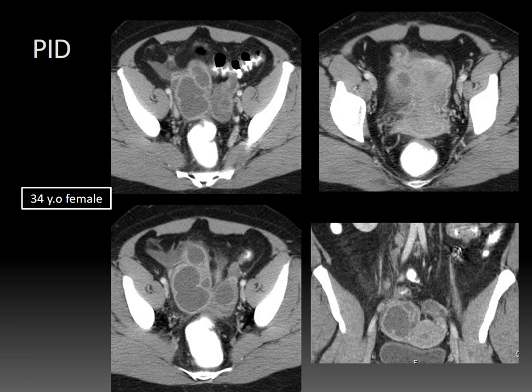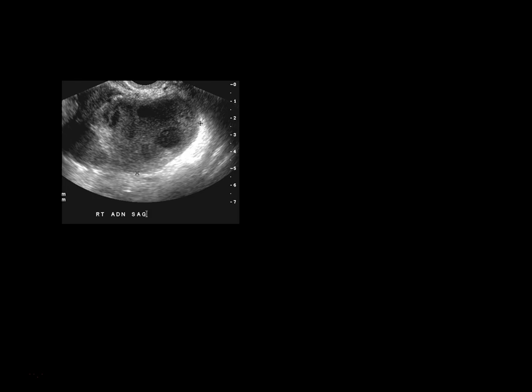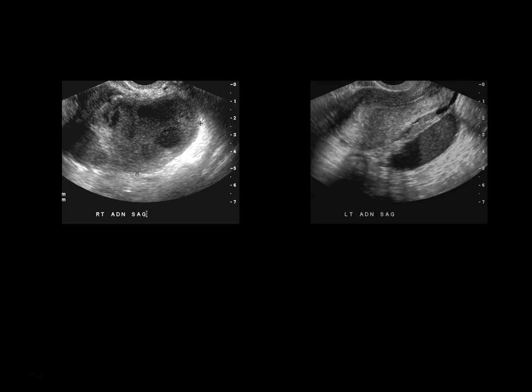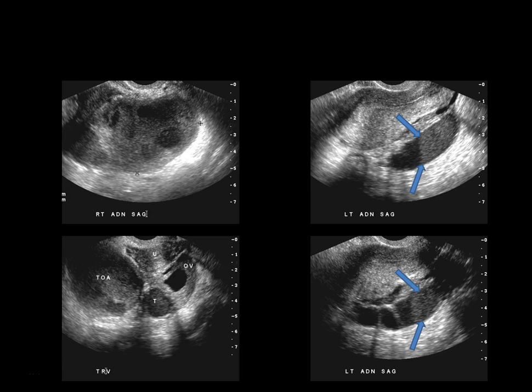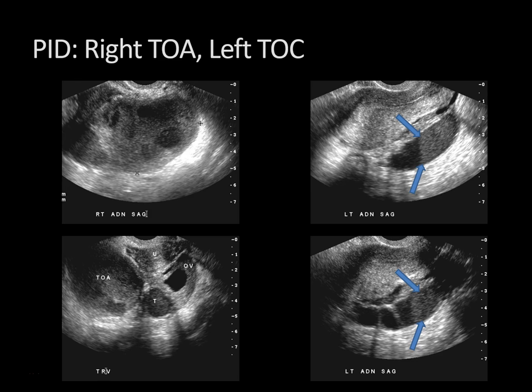Here's another case. There is a collection on the right and a dilated fluid-filled tube on the left on CT. On ultrasound, we see a tubovarian abscess on the right. On the left, there is a fluid- and debris-filled tube posterior to the uterus. On the transverse image, you can see a right tubovarian abscess and, on the left, normal but inflamed ovary adjacent to a debris-filled tube — that's a tubovarian complex on the left and a tubovarian abscess on the right. The uterus is identified anteriorly between these structures.